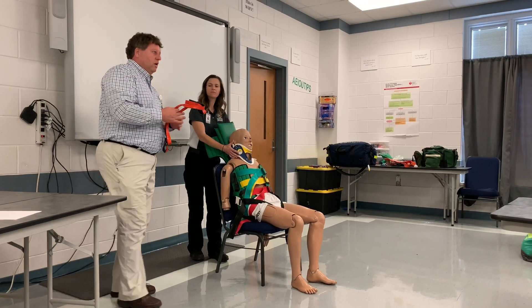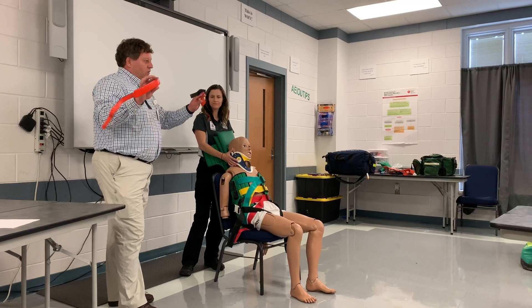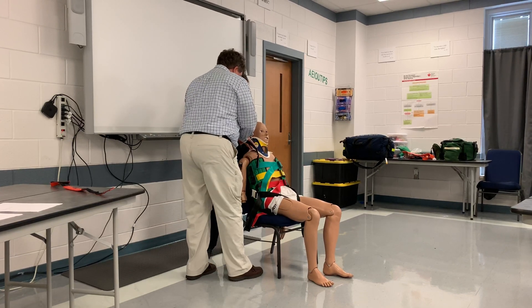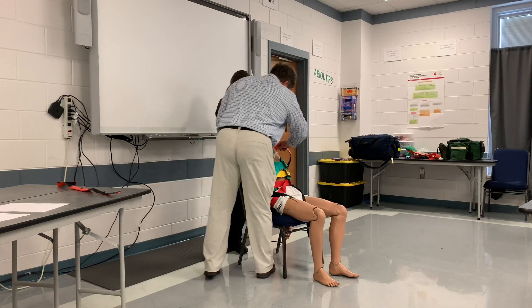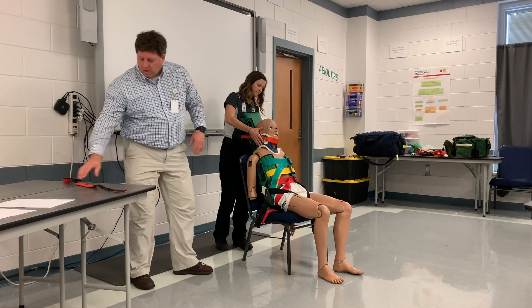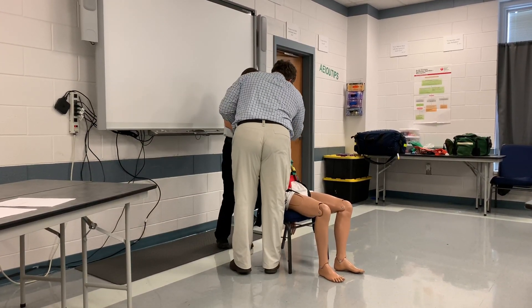Normally these straps are white - it's one of the first things that gets lost with your KEDs, the head straps. These are the same straps that we use for our back work and they work. Go across the chin, get in on both sides - don't do it at too much of an angle. Go across the top, angle it down a little bit.